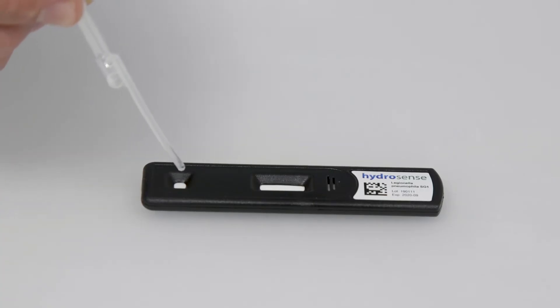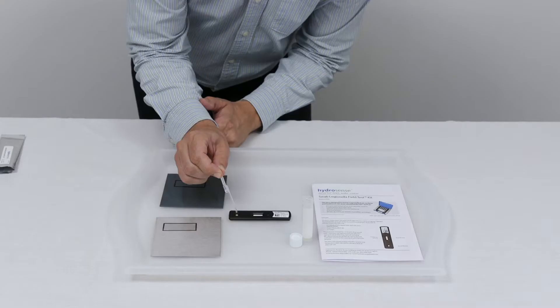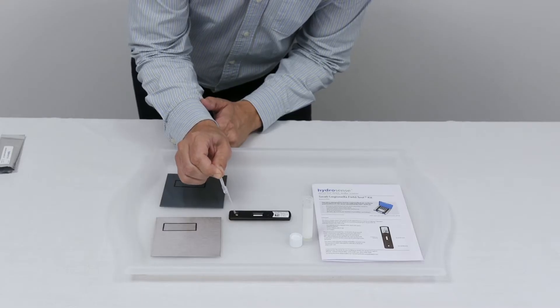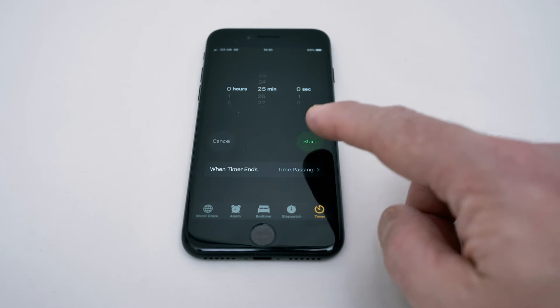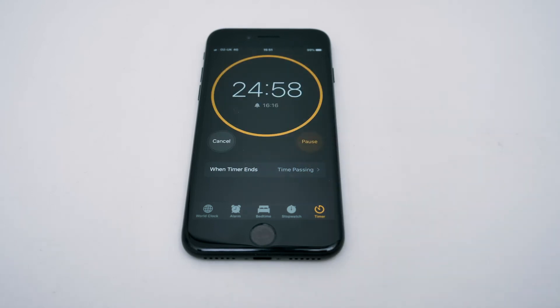To transfer the liquid from the tube into the cassette, we press the top bulb again by holding the pipette over the test. Make sure all the liquid is dispensed, and then we will start a timer for 25 minutes.